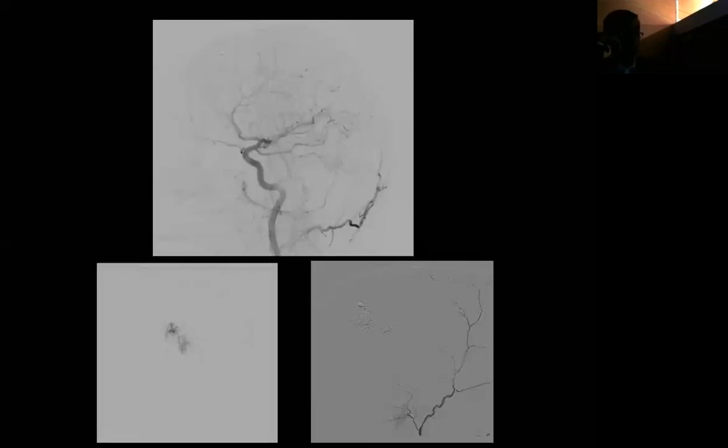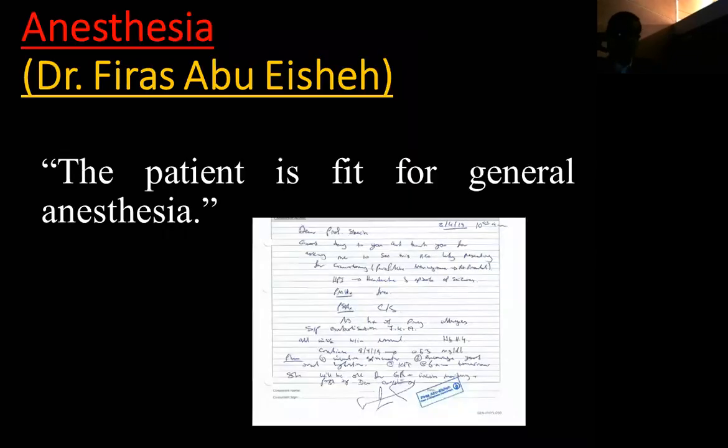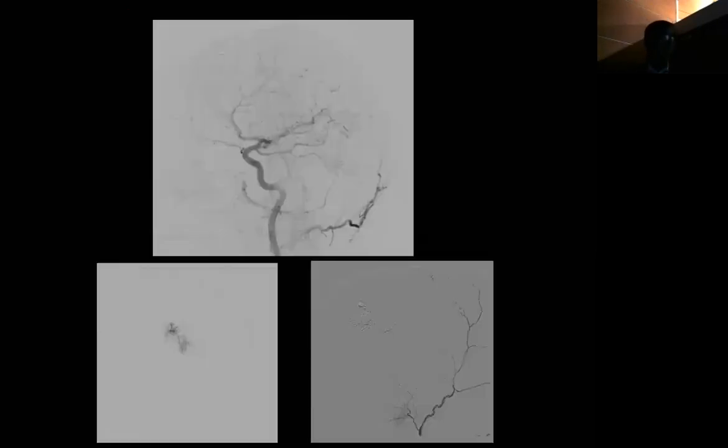You start filling the tumor slowly, and you fill sometimes the tumor itself. And you will find that when you start to inject, it will seep into the different collateral supply from internal and external. This is where you have to be careful so that you avoid cortical infarct or ischemia and infarction. And I think we achieved more than 70 to 80% occlusion of the tumor vascularity just by one catheter in the center of the tumor, advancing the liquid slowly, and getting the liquid to expand at the periphery of the tumor.